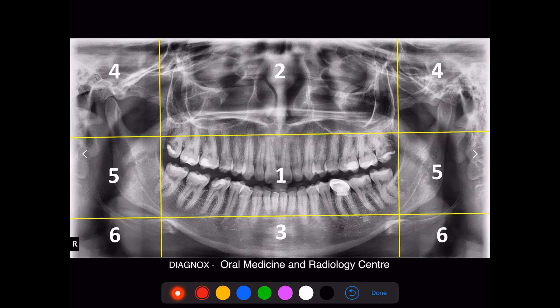Once you confirm that, go for the morphology of each and every particular tooth. Once you confirm these three things, then pick each and every tooth individually and check for its findings. I always start with tooth 18, then go towards 17, 16, and finish till 28, then come towards 38, then finish till 48. Keep one particular pattern so that you don't miss any tooth or any findings.